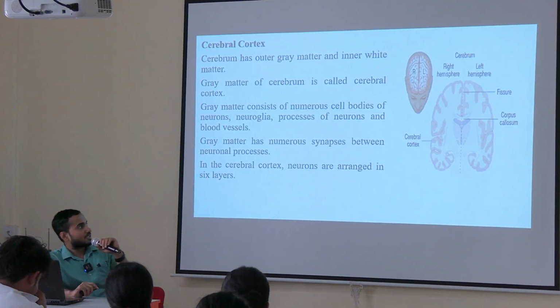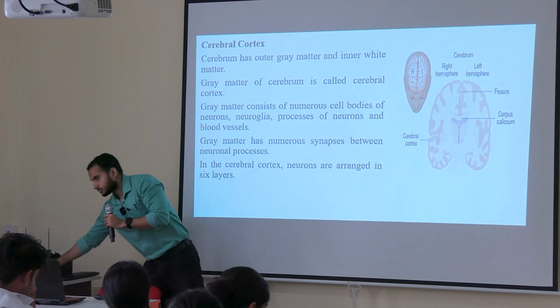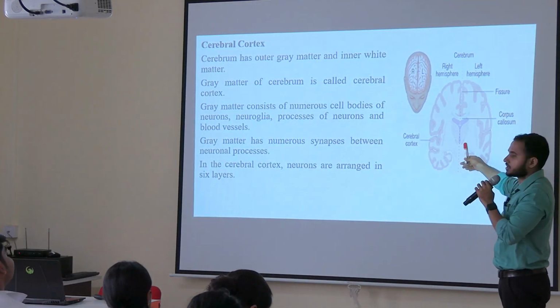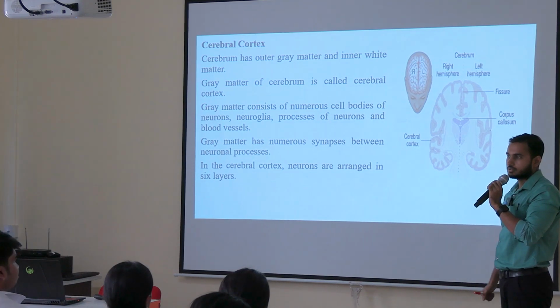For your reference, you can see the diagram. Now, can anyone tell me which section of brain this is?